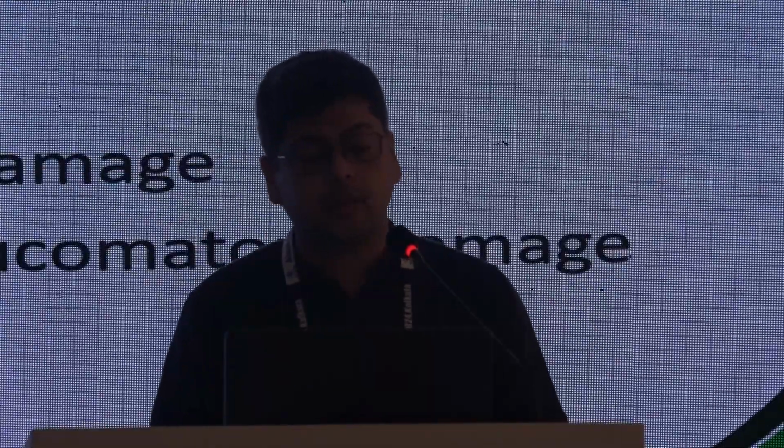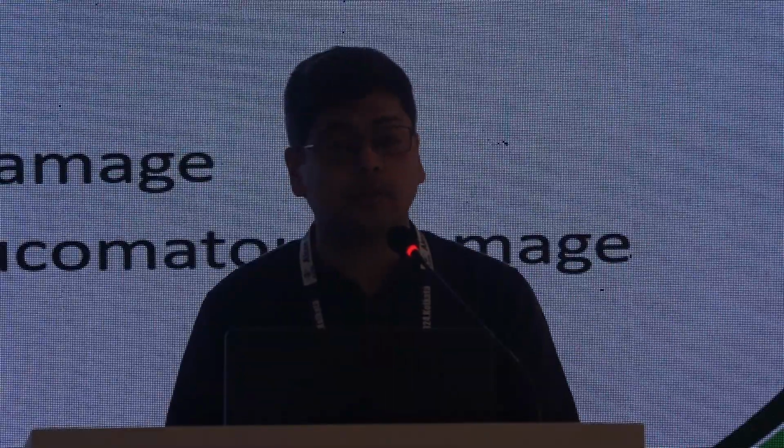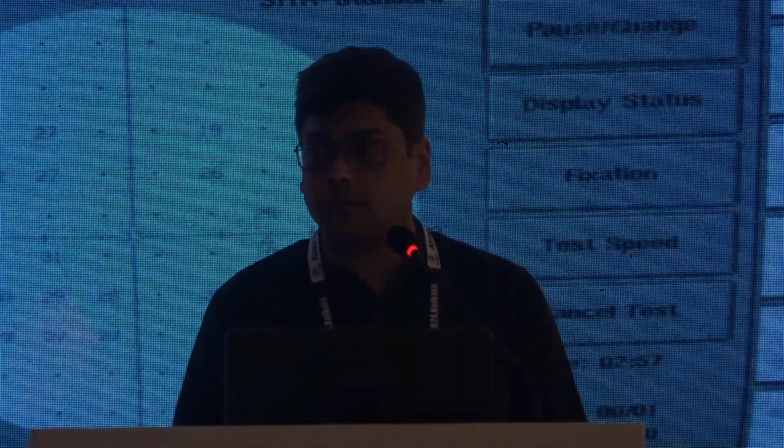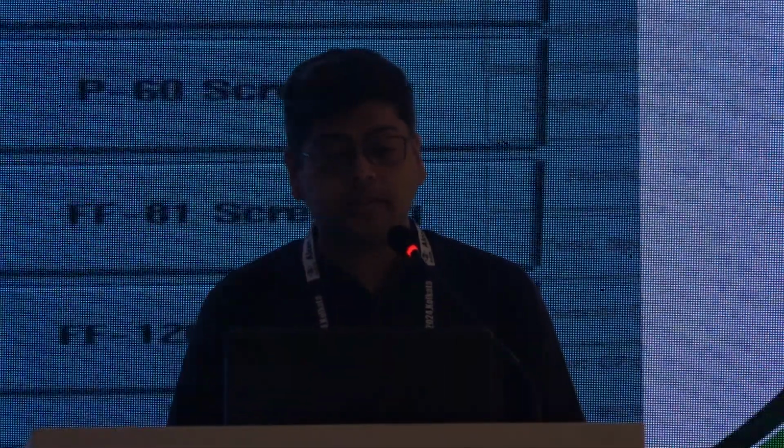It involves stimulus presentation to the patient and recording of the responses of the patient to these stimuli, which is a standardized procedure. The initial test detects and quantifies the damage, while the follow-up test detects stability and progression of the glaucomatous damage. The stimulus size, intensity of light stimulus, and the algorithm for testing are all very standardized. These are the common testing patterns we use normally. Today, mainly what we are going to discuss is the interpretation of a Humphrey visual field, the pattern recognitions in glaucoma and non-glaucomatous visual field losses, and common mistakes which we may avoid.